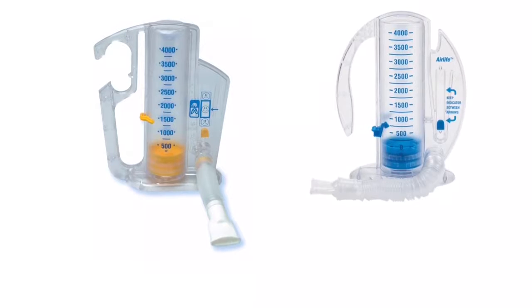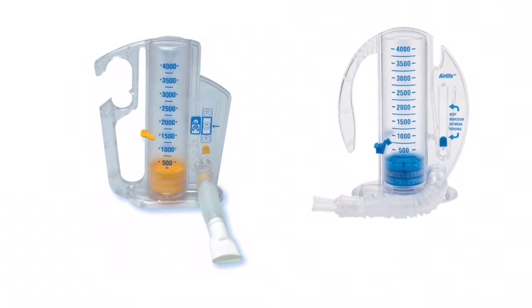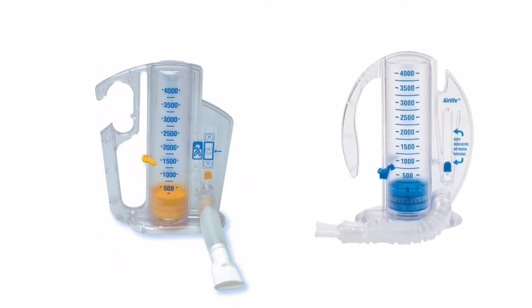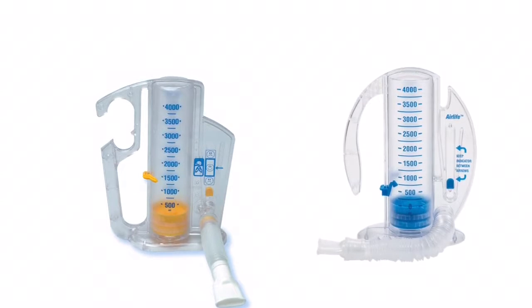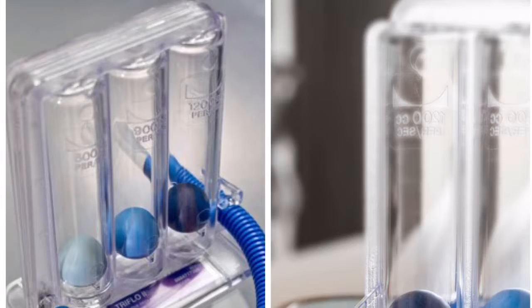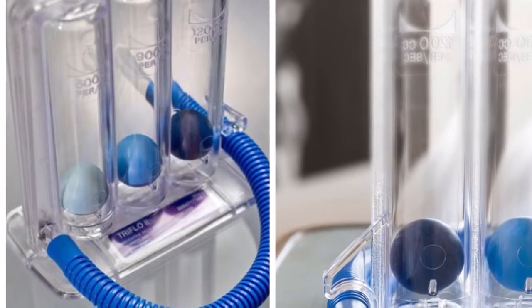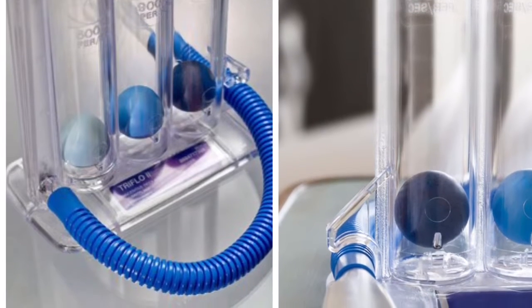Equipment needed for this form of therapy includes the IS device, the 6-inch corrugated tubing, and the patient's mouthpiece. IS devices can generally be categorized as either volume or flow-oriented. Volume-oriented devices actually measure and visually indicate the volume achieved during the SMI maneuver. Flow-oriented devices, on the other hand, measure and visually indicate inspiratory flow. This flow is equated with volume by assessing the duration of inspiration or time. Today, we will be using a volume-oriented IS device.